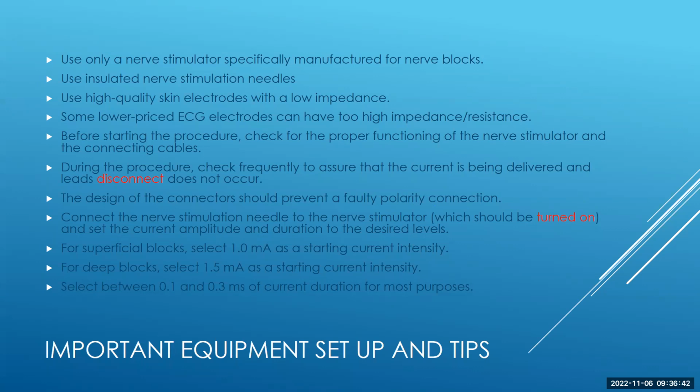It's going to go from a red light to green, with a change in pitch and color. You notice a little difference in the pitch, a little click sound, that alerts us that we have completed the circuit and everything is functioning properly. The design of the connectors is normally pretty good. They're kind of hard to connect, so they keep together. But stuff happens, so make sure the correct nerve stimulation needle is connected to the nerve stimulator, and that it's turned on.